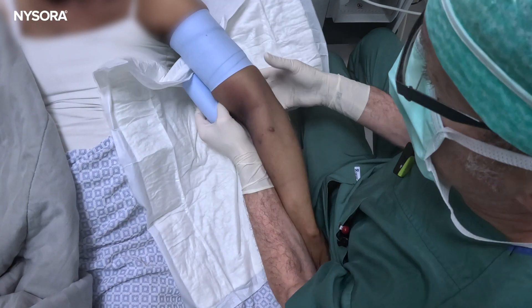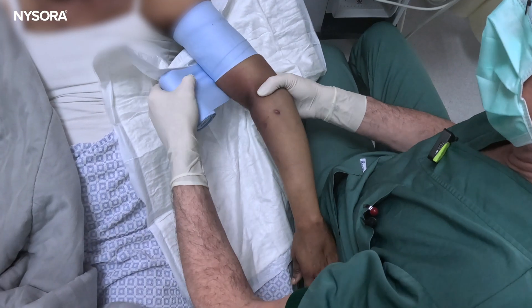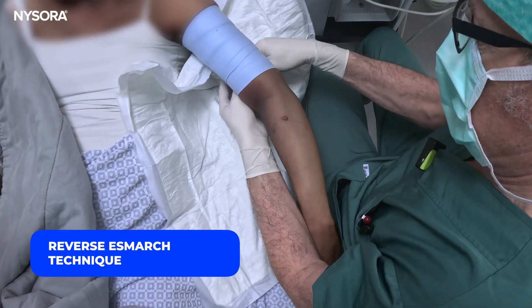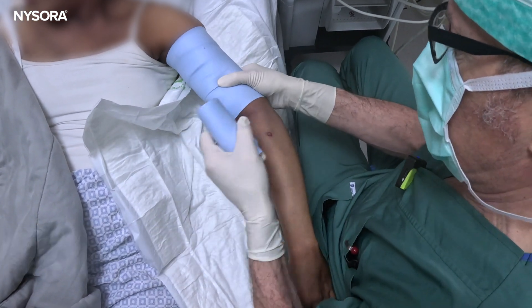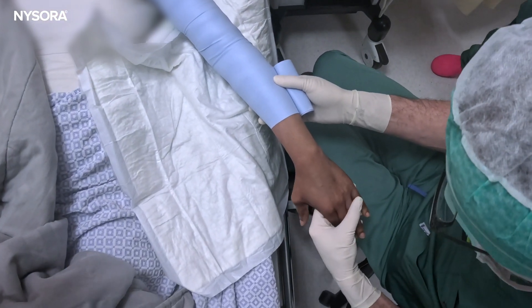Applying the tourniquet: tighten and wrap, tighten and wrap, tighten and wrap. Now we want to wait to see what happens.